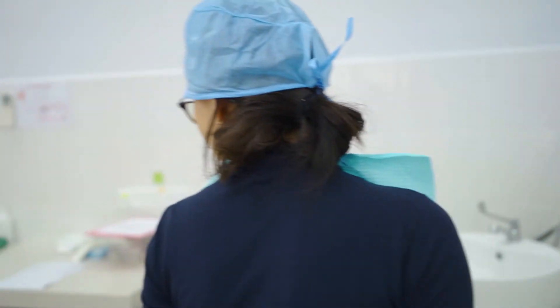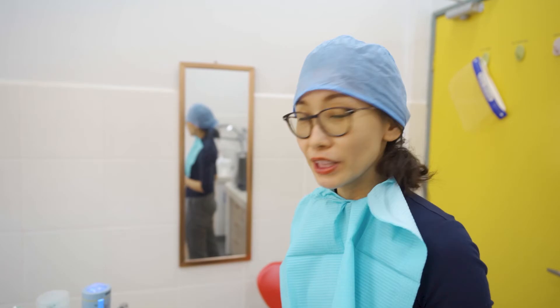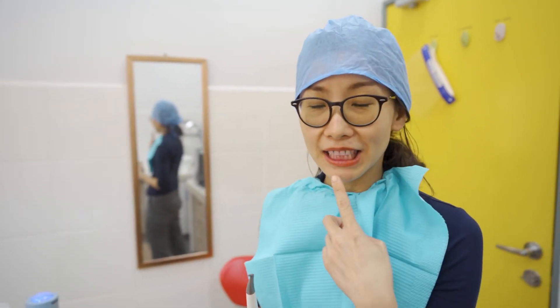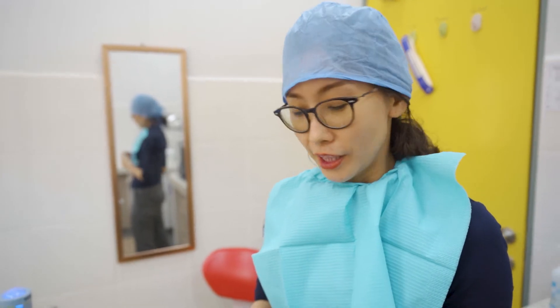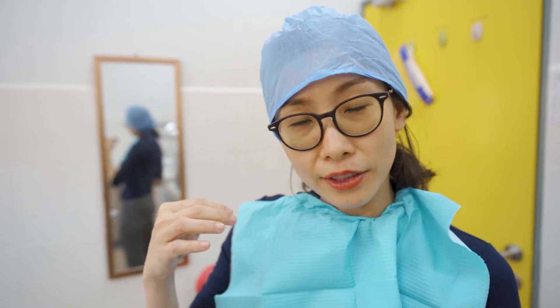I'm going to use airflow. Do you know why airflow? After I expose the plaque on my teeth surfaces, I'm going to remove it by using airflow. It's using powder to sandblast on the surface to remove the supragingival plaque — the plaque above the gum level.